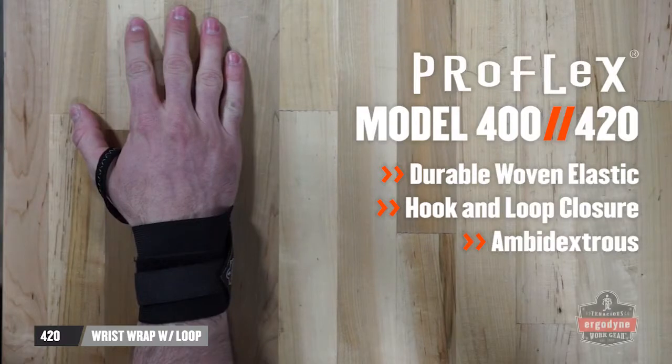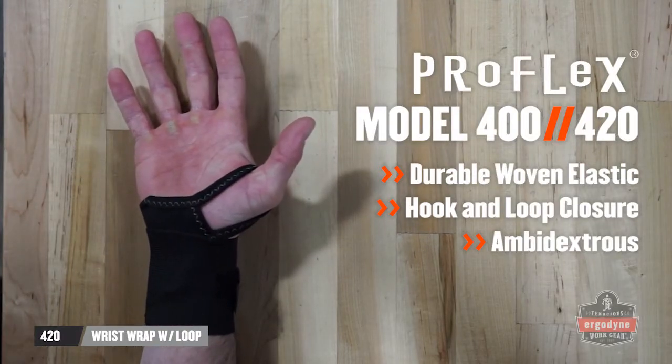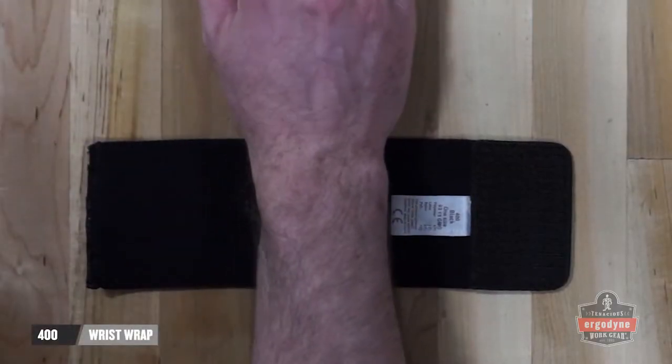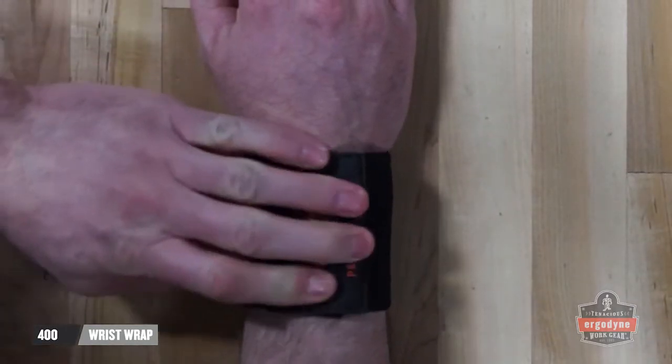Ergodyne's lightest wrist supporting solutions are the 400 and 420 wrist wraps. Constructed from durable woven elastic, these ambidextrous wraps feature a hook and loop closure and can be tightened to the desired fit and tension for warmth and discomfort relief.